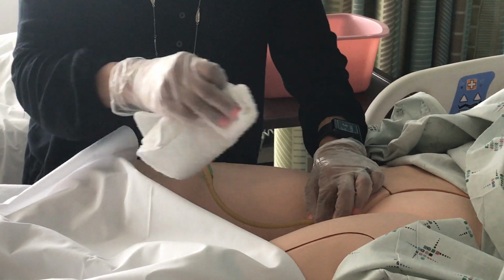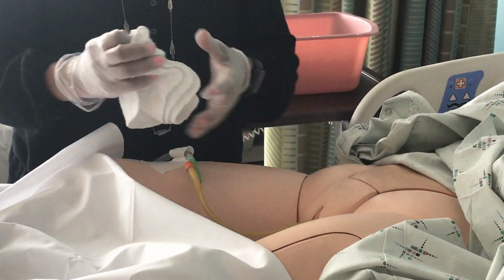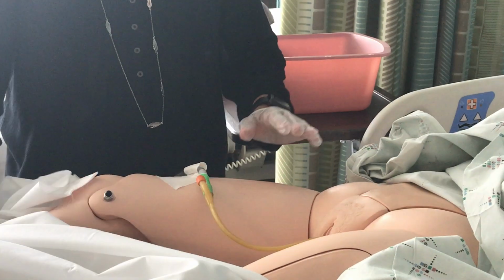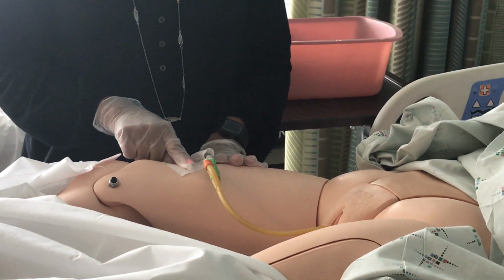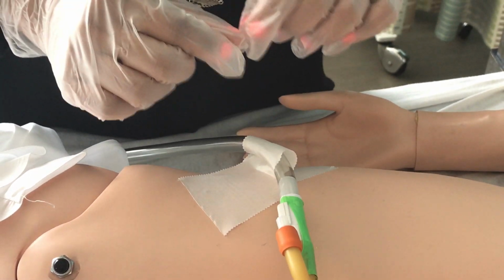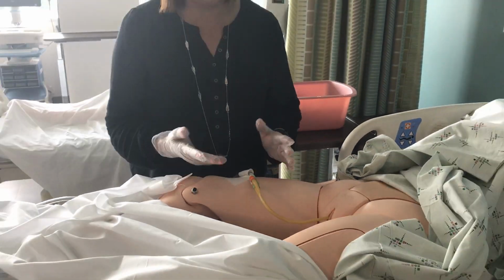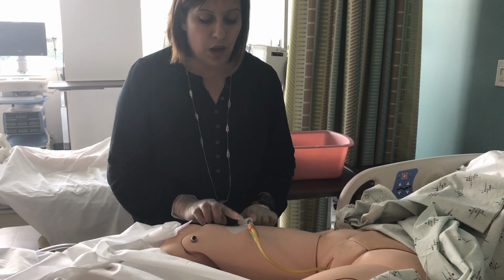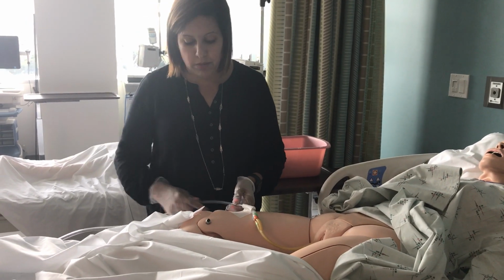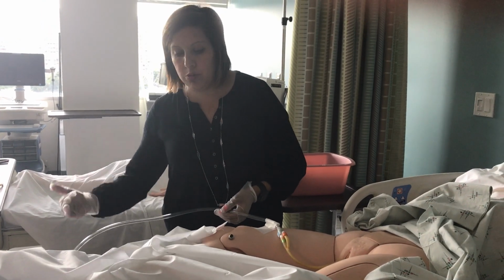You don't want to tug on this in any way and pull it. You just want to clean this downwards, because this prevents infection. You also want to make sure that they have a tape on. For females, they should have a tape on their thigh. Sometimes they have a stat lock, which comes with the kit. Keep in mind that catheters are always inserted by a nurse or a doctor, so you as a CNA will not be inserting this. The tape ensures that it doesn't move around, and that the line is not kinked in any way. It's free flowing, because the urine should be flowing downward.